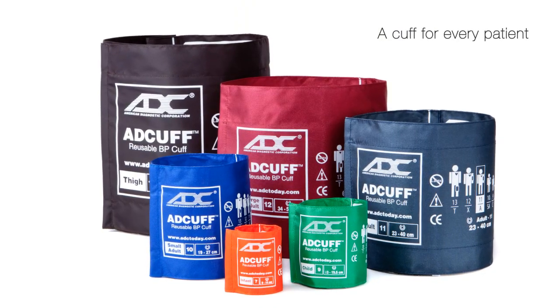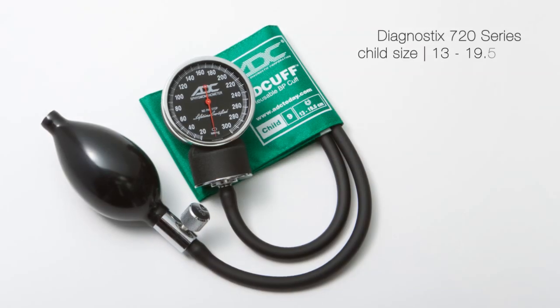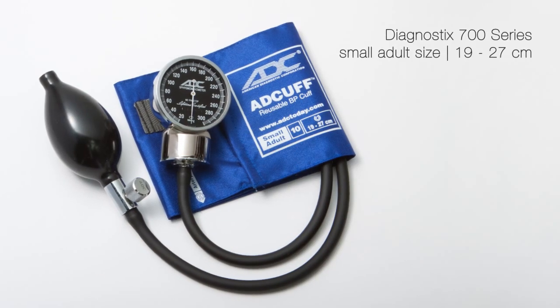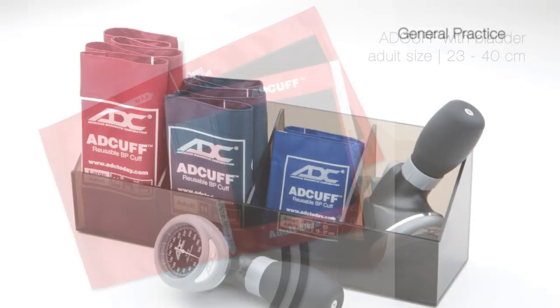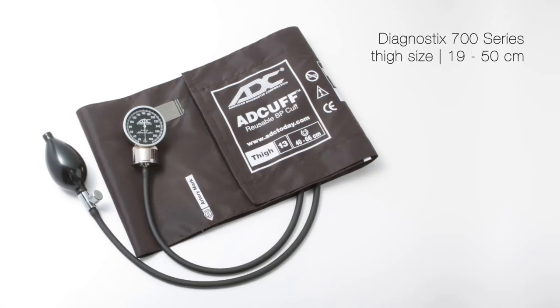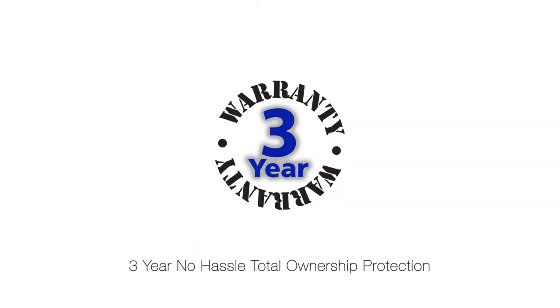Available in six sizes covering limb ranges from 9 to 66 centimeters and over a dozen color options, the ad cuff is standard on all Diagnostix and most Pro-Sphyg brand ADC sphygmomanometers. It is also sold separately for use with virtually any manual or automated NIBP monitor. Ad cuff inflation system components are covered by the industry's most comprehensive warranties.